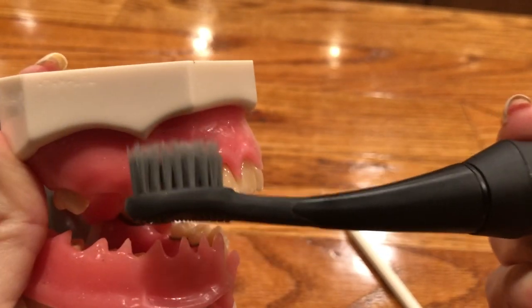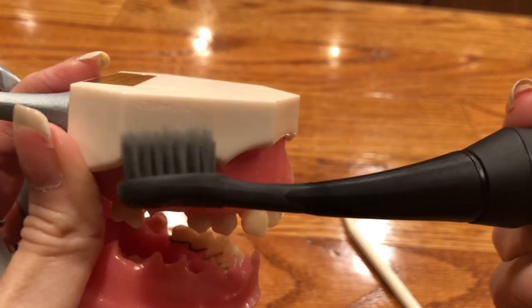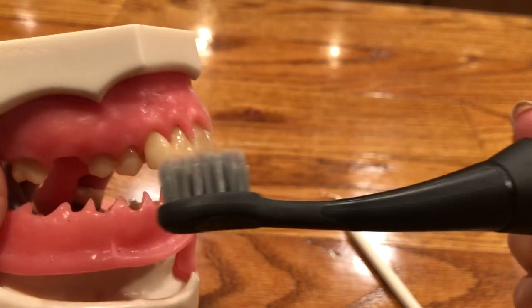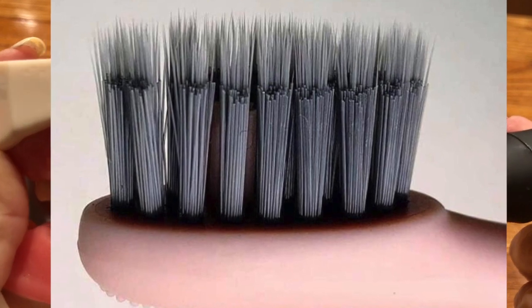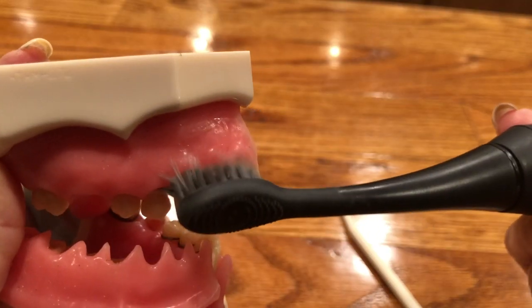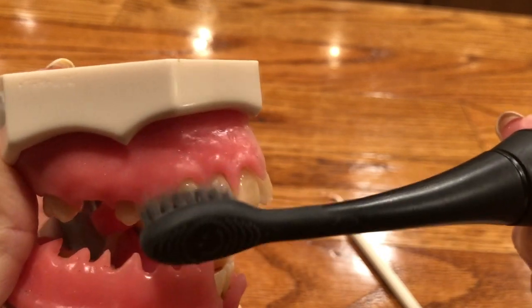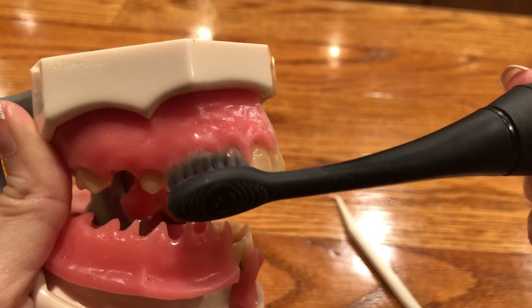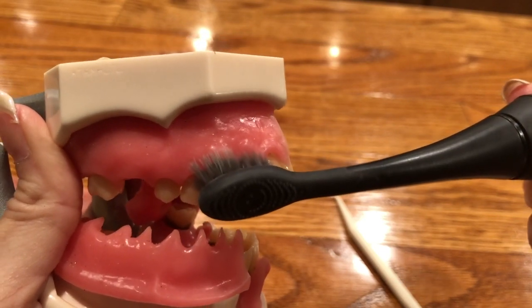When you have an electric toothbrush, and you guys that know me know that I love this Burst because the bristles are tapered. See how when I kind of tilt that, you can see that? The Burst, when you angle it at a 45-degree angle towards the gum line, it gets down below the gums and it massages the gums, and sometimes if they're this bad, it could take 7 to 14 days to make this be healthy.